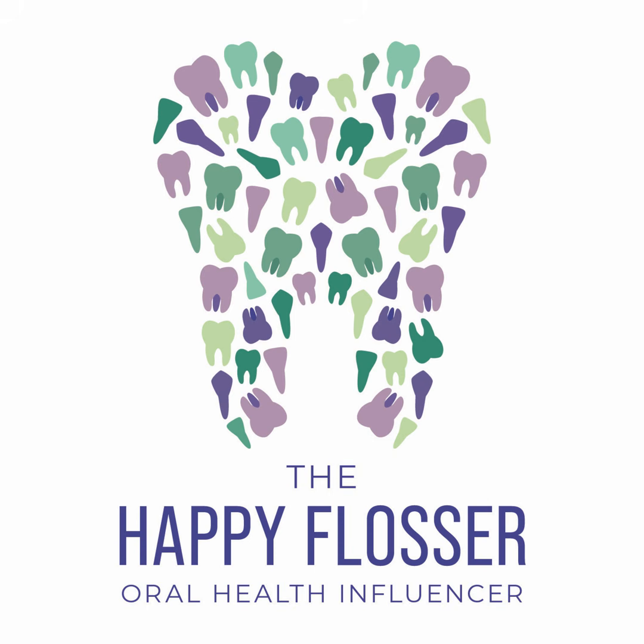When you are doing your medical history, we're going to go over some of the key components here. When you're going over the medical history, you want to try to establish if your patient has sensory issues or has a gag reflex, or maybe latex or alginate allergies or dental anxiety. Those things are all really important for you to know before you are putting an impression tray in your patient's mouth. These things will go a long way at helping you with the preparation process, things that will guide you on how you're going to approach that patient to take that impression.